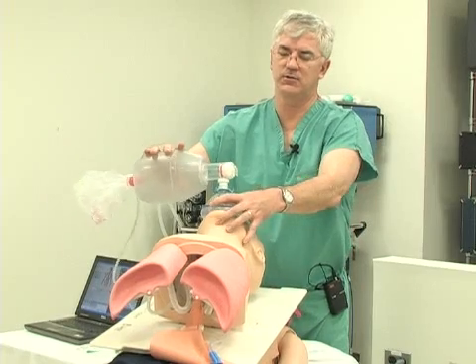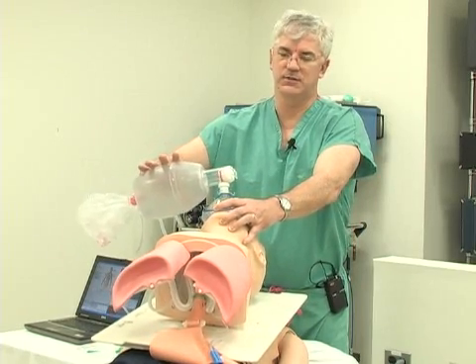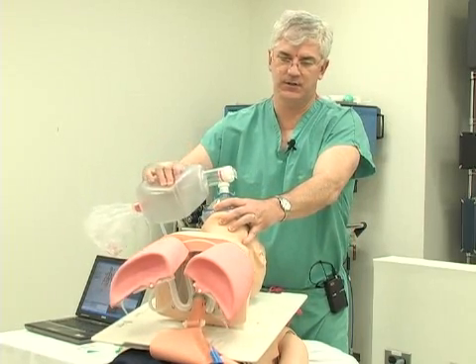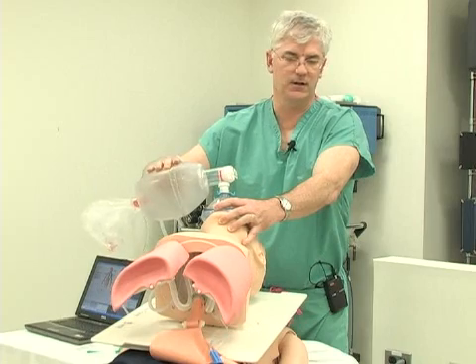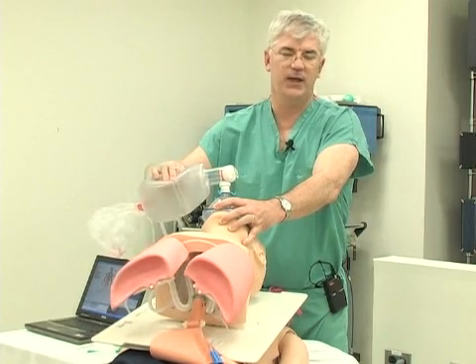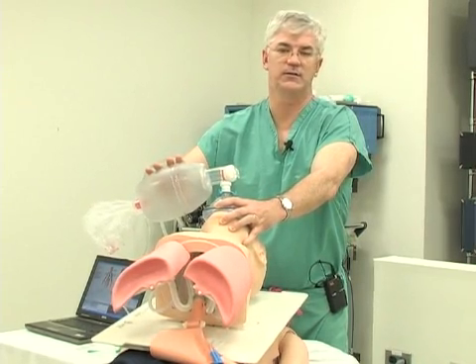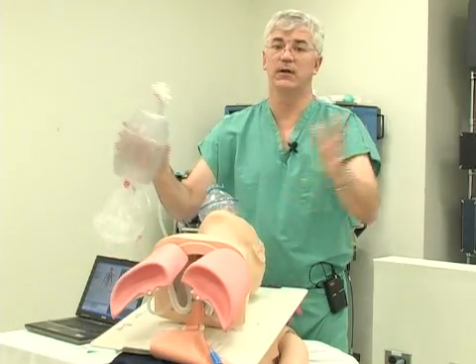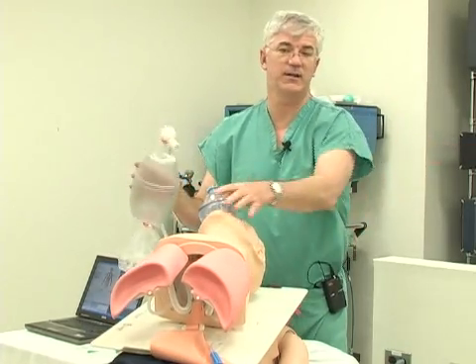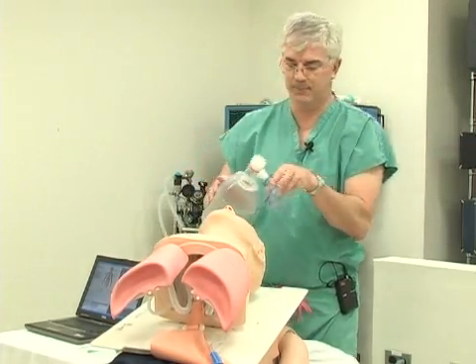You want to make sure you lift the jaw, get a good seal, squeeze the bag, and confirm the lungs are going up. You're going to have to demonstrate that you can do this during your ACLS certification. Enough said — we're anesthesiologists, we do this every day.